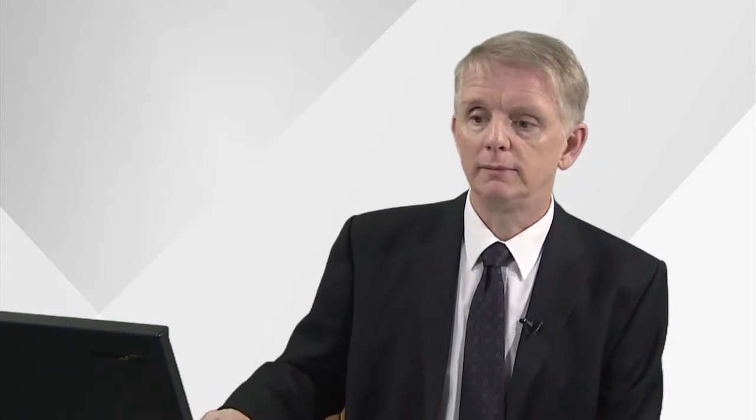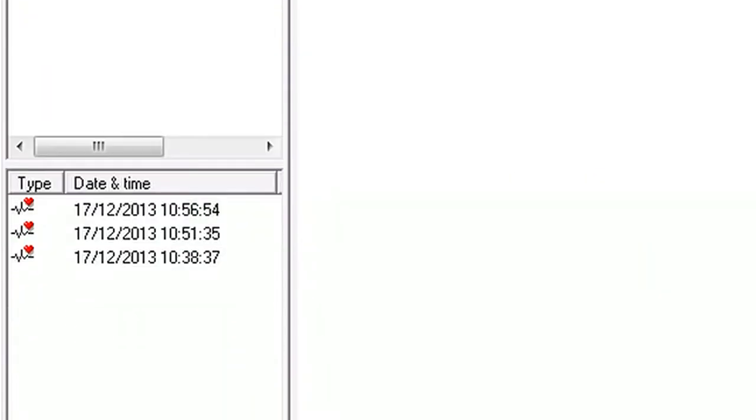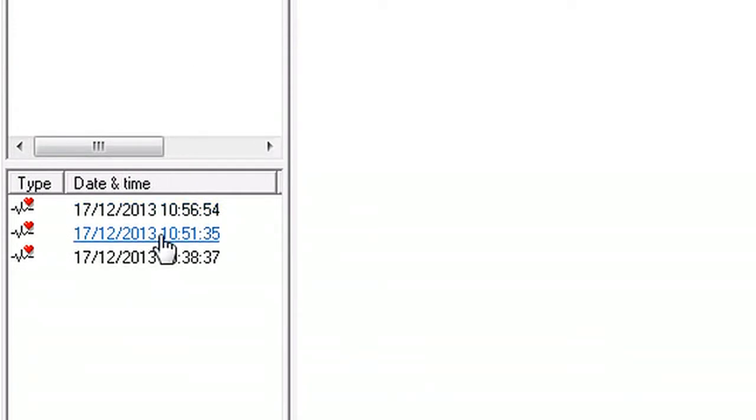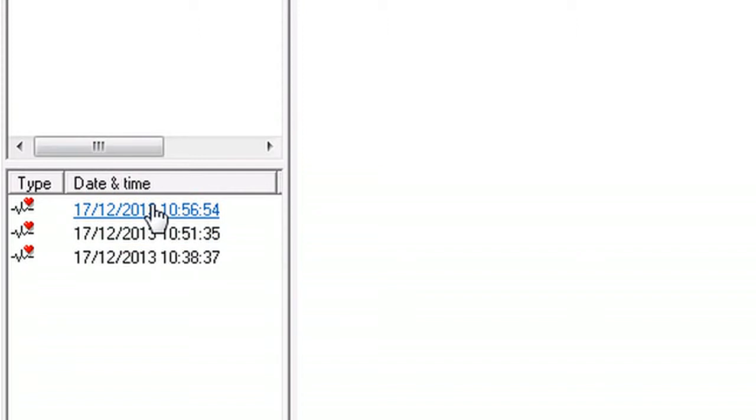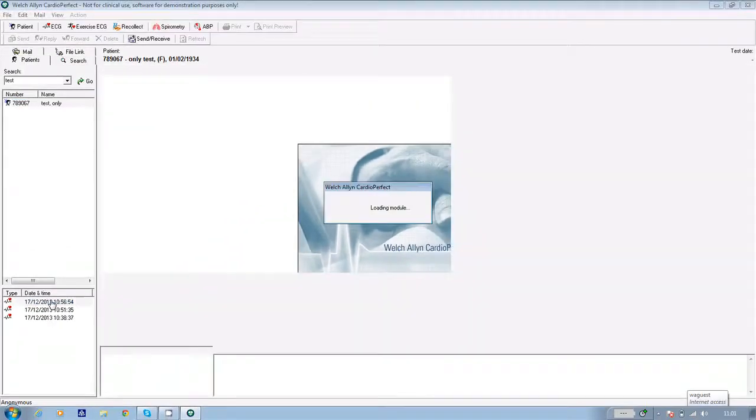If you ever want to look at previous recordings, open the software, highlight your patient's name, and in the bottom left hand corner of the screen you'll see a list of any other tests. To view them, just highlight the one you'd like to study and it'll appear on screen.